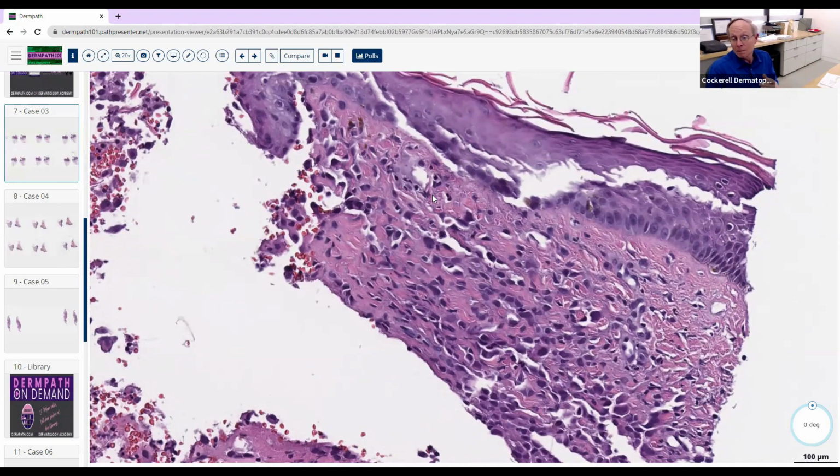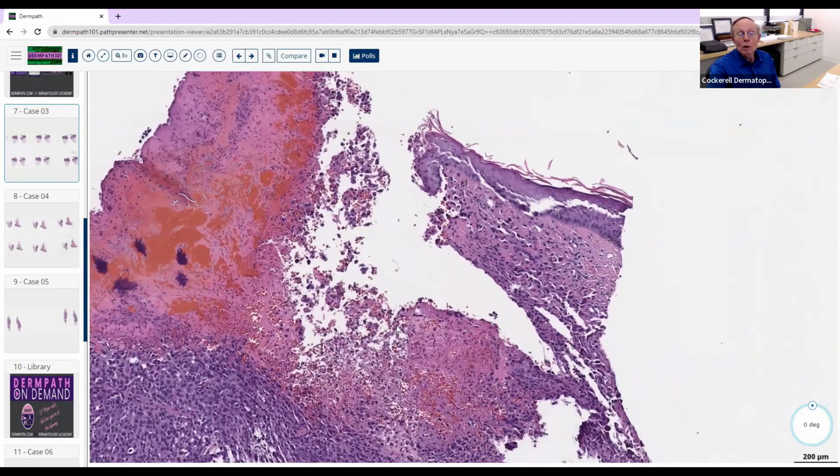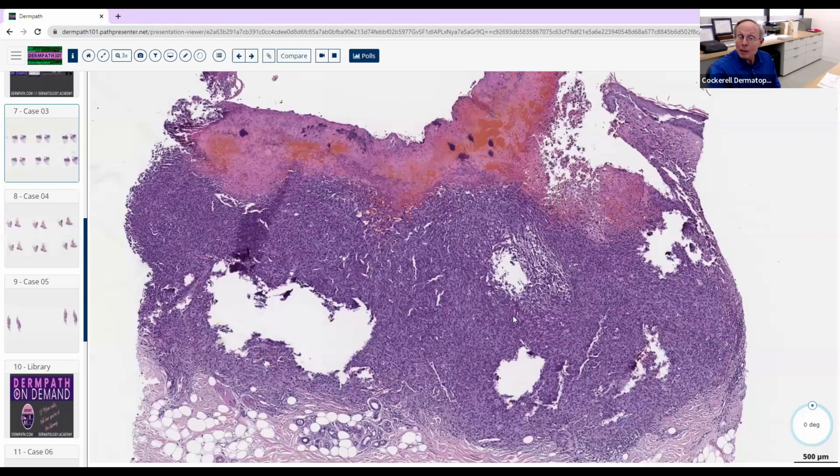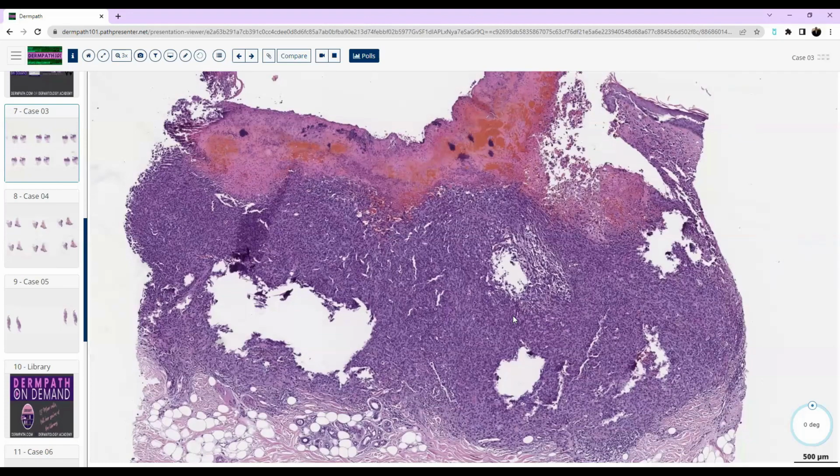The rest of it just looks epithelioid and says, wow, it's probably a cancer, but we're not really sure which one it is. So this is just an example of a situation where you get epithelioid cells giving different morphologies to things that we don't really normally think about very commonly. So just remember that this is yet another cancer that can give you an epithelioid morphology. Now, one thing I'll caution about: whenever dermatologists and soft tissue cancers come together, it's usually like a train wreck. Usually there's a problem. And so I've seen cases of angiosarcoma taken by shave technique, and it gets misdiagnosed as an ulcer.